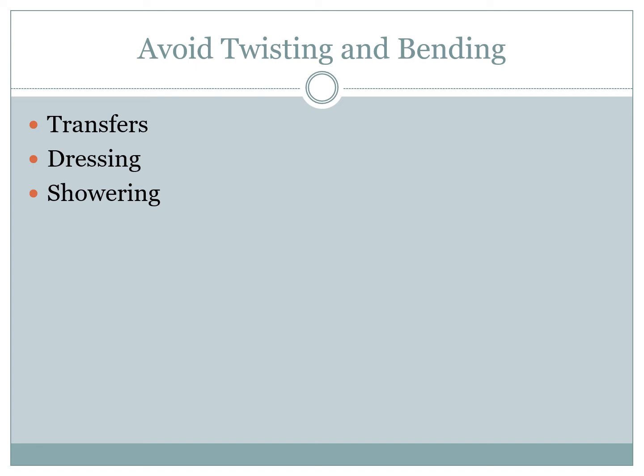We also assess the patient to see if they require long handle dressing aids in order to assist them with lower body dressing. If the wearing regime of the brace is for wearing during the day and can be removed at night, we also advise patients that the brace can be removed for showering once they adhere to the spinal precautions. This means maintaining a straight position when in the shower, so ensuring no bending for toiletries.